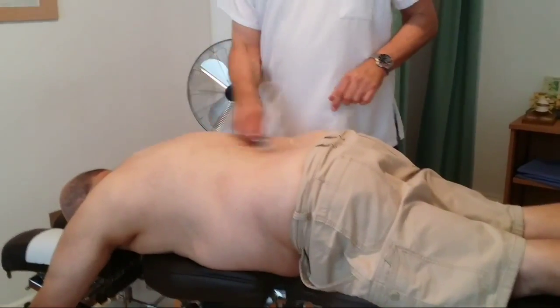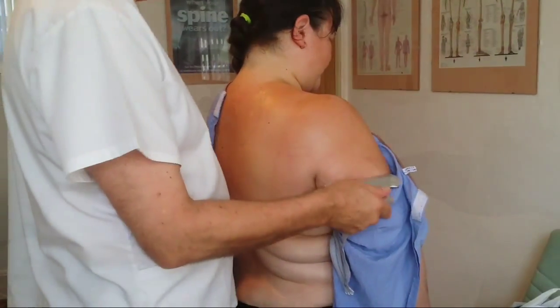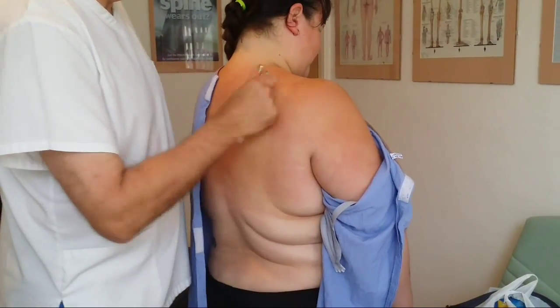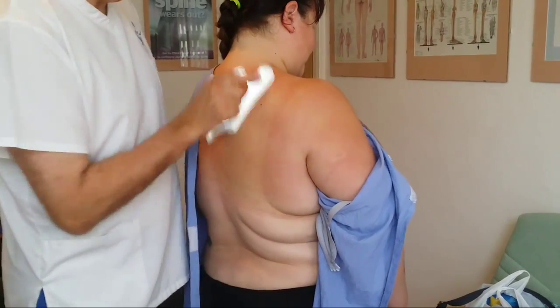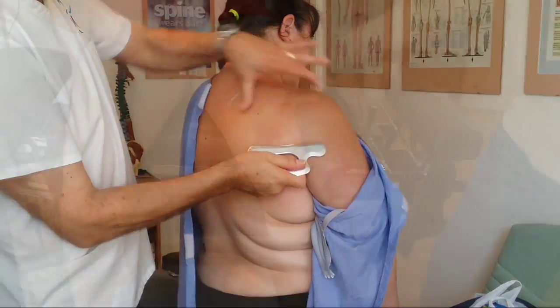Looking at these videos, you'll see how smoothly our instrument can be used. It has a large specialised concave edge, which allows it to be used on all muscle groups including large flatter areas such as the back, hamstrings, quadriceps and shoulder areas.